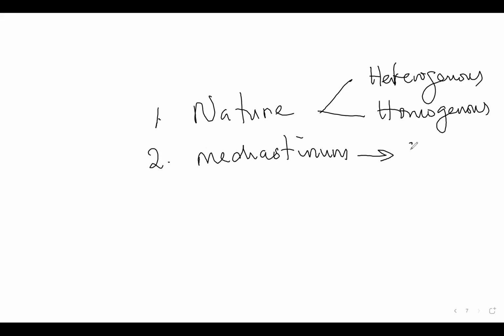So is there mediastinal shift? And this mediastinal shift, one, it could remain unaffected, okay? It could shift to the right or it could shift to the left.